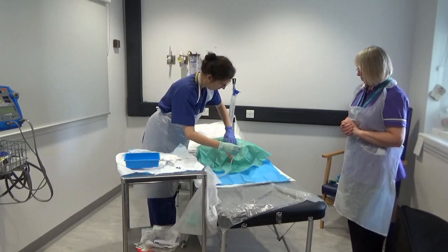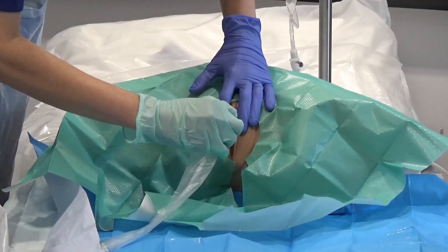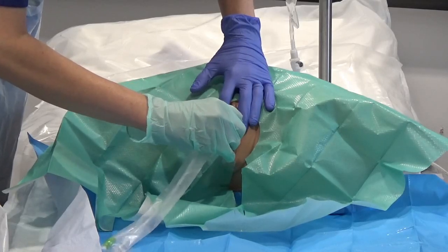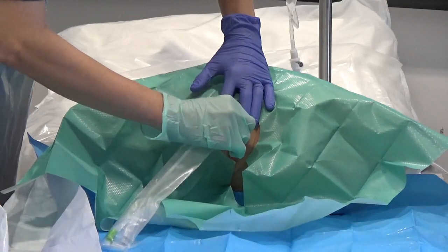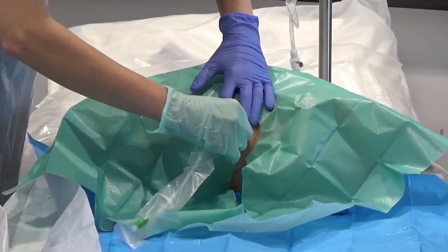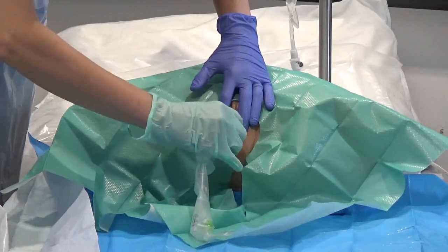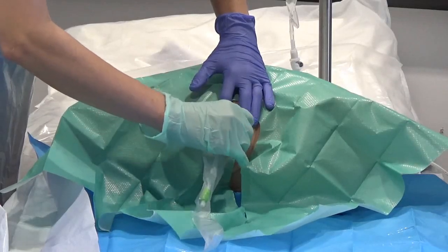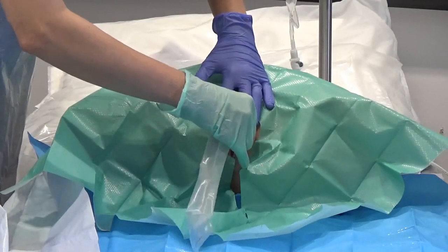I'm not taking it out of the sleeve, but using the sleeve itself to handle it — and whatever I do, I am not touching the tip with either hand, clean or dirty. Going back to the patient, gently spreading the labia majora, finding the external meatus, and then trying to insert the tip in there. This is actually easier on a real patient — the model can be quite stiff. Gently roll the catheter and push it forward — you can see how I roll it and advance it. Remember, you only have about three centimetres to go in a female. Pull back the sleeve as you advance, not touching the catheter. After about three centimetres you would want to see the first urine coming into the sleeve.